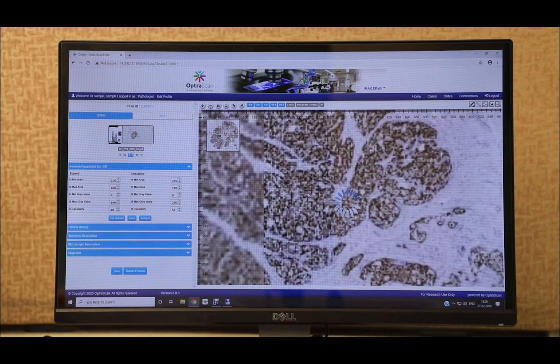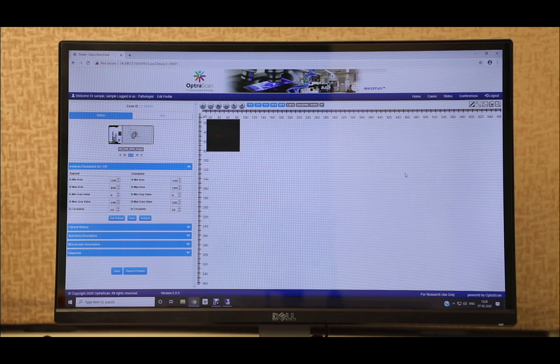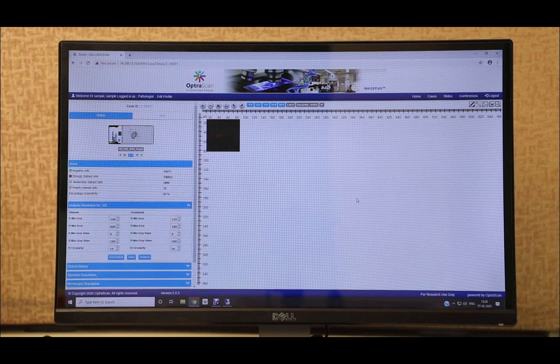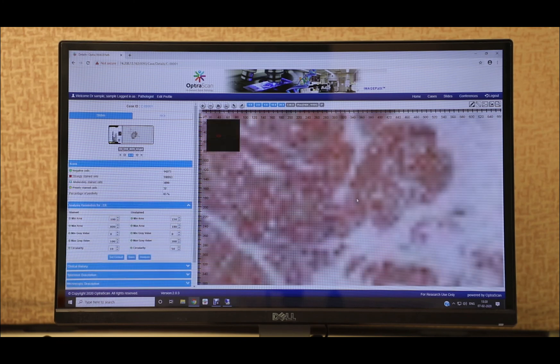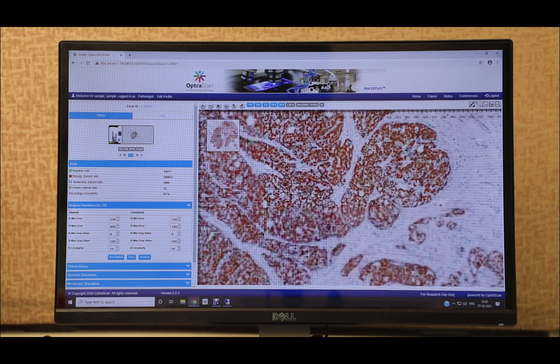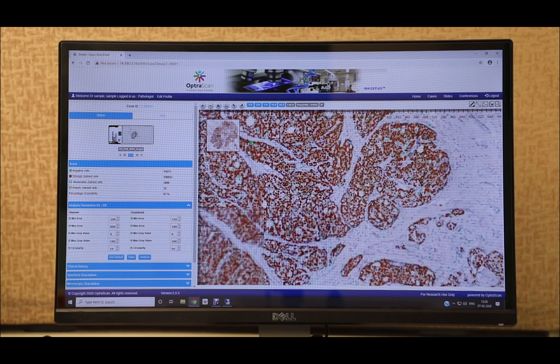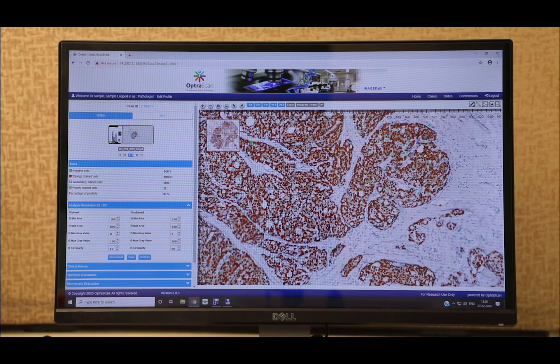The example seen here is an immunohistochemistry slide with an ER biomarker. We have opened some parameters that allow us for fine-tuning of the algorithm to produce accurate results. The users can toggle between the raw image and an analyzed image overlay.